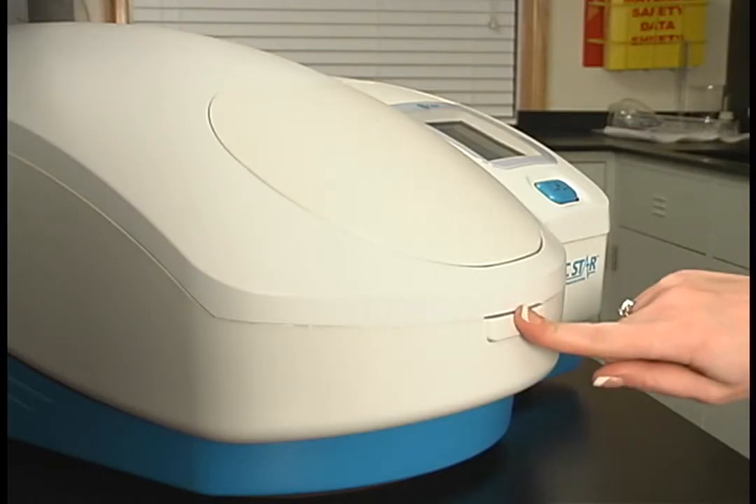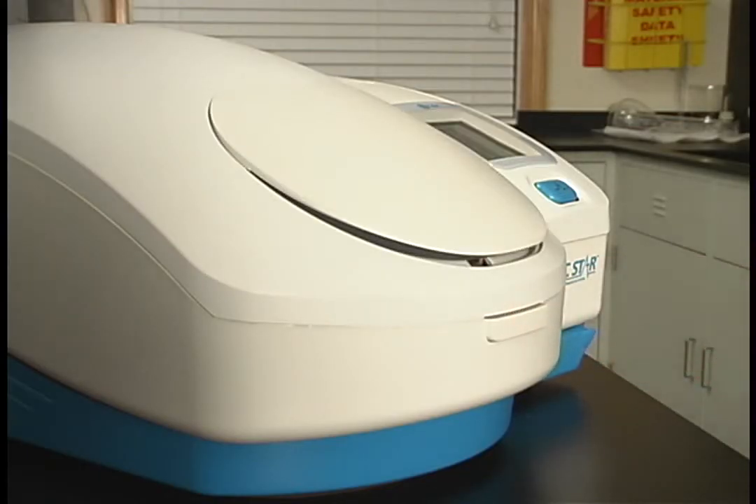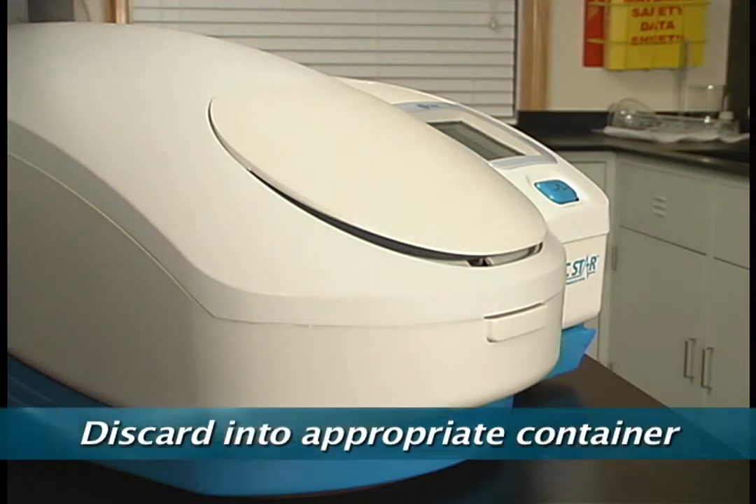To remove the tube, press the release latch located on the front of the instrument below the sample door. Simply retrieve the tube and discard into an appropriate container.